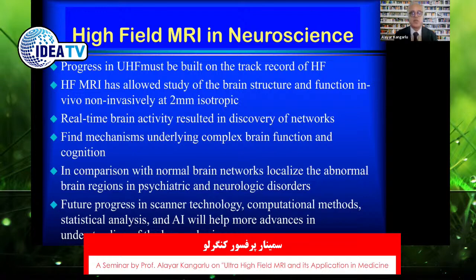People are investing more than $500,000 to build these local xenon-129 or helium-3 polarizers to be able to acquire lung images from their MRI scans. So there are plenty of options for doing non-hydrogen, the so-called low gamma nuclei of sodium 23 and phosphorus 31 and so on. So, okay, thank you. So contrast agents, basically, that's what you're doing. Okay.